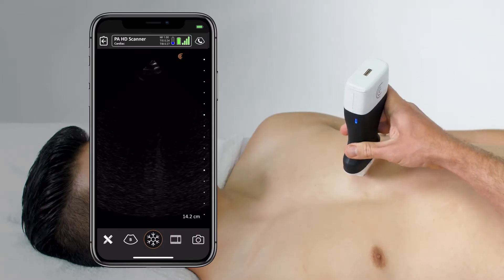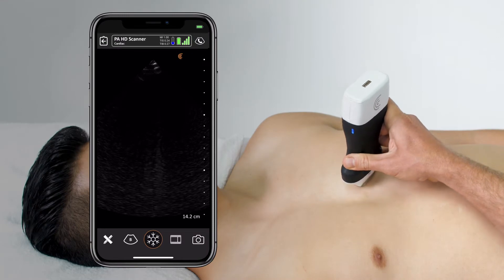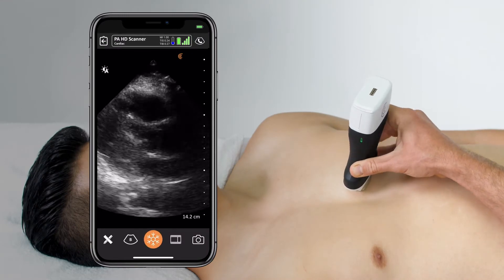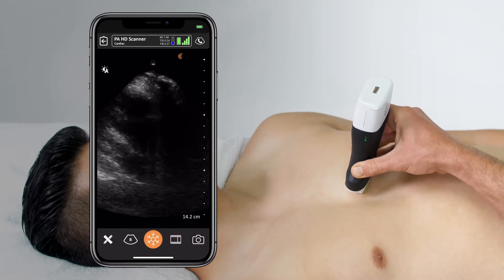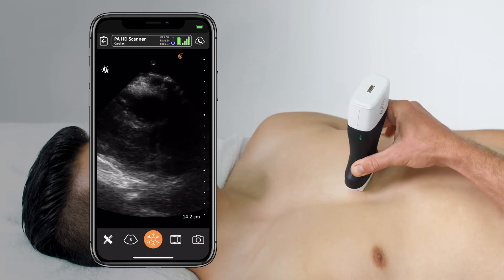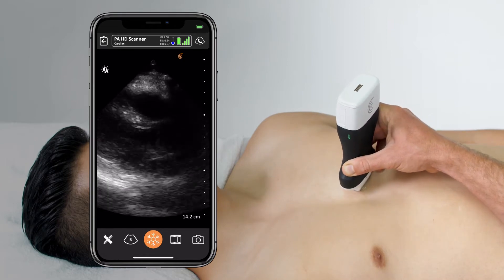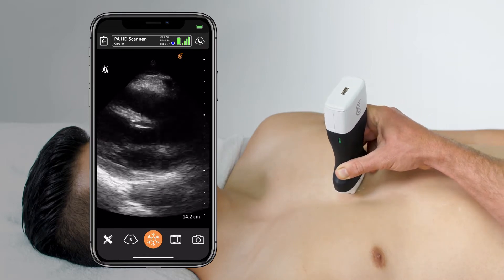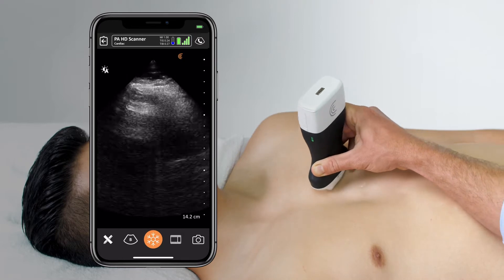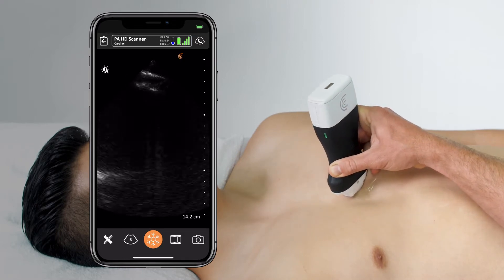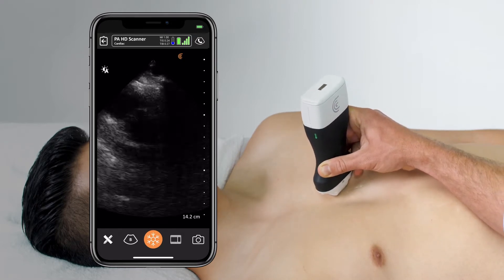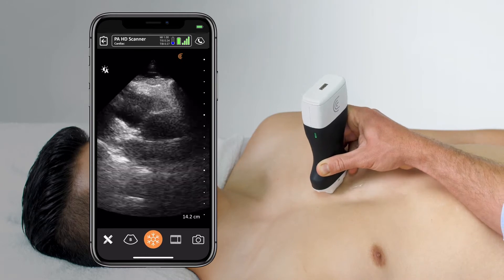I'm going to place it at the left sternal border. I like to break this scan up into several different steps. The first one is window shopping. By holding the transducer at one angle, I'm going to slide up and down that left sternal border to find the window where the heart appears its brightest through the lung.